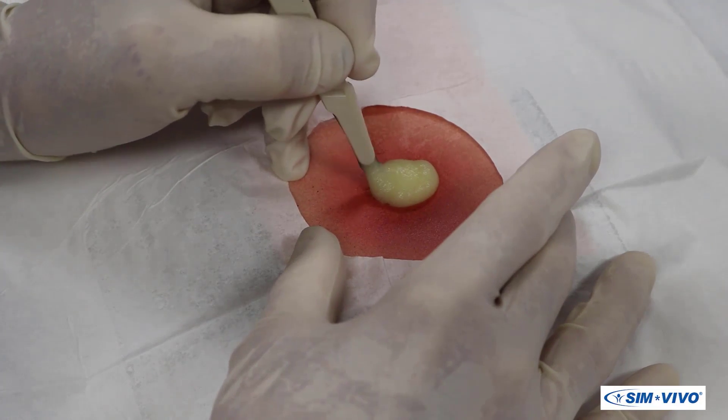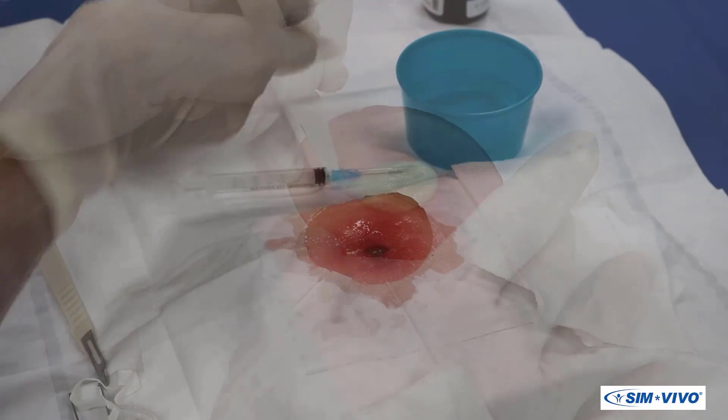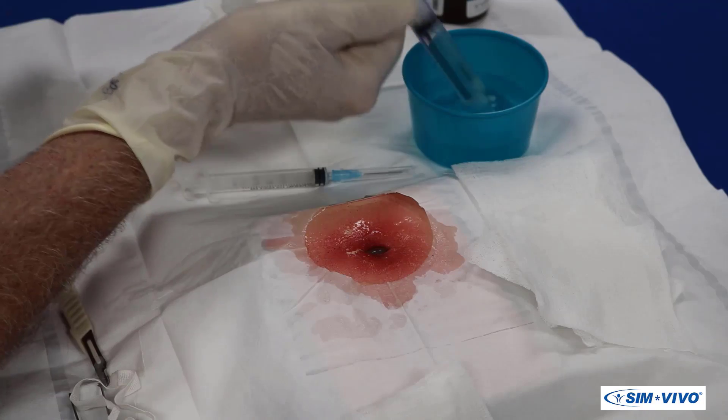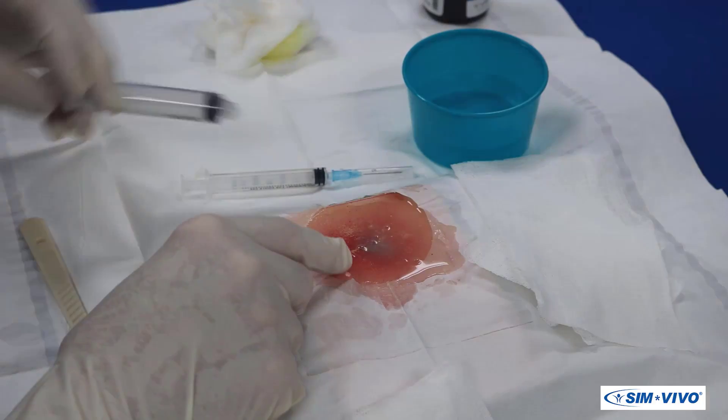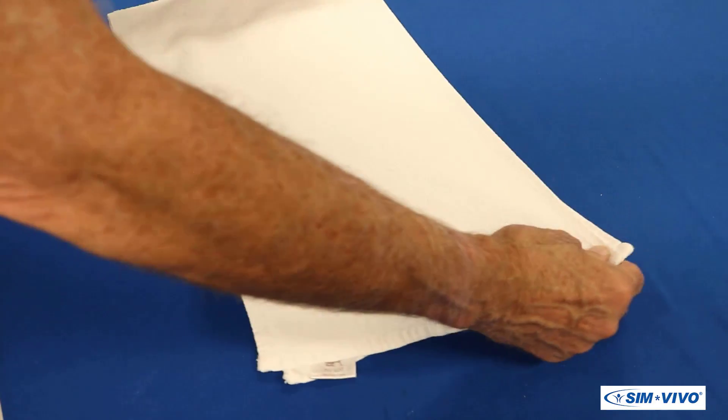Let's get started draining an abscess. Since the complete evacuation of the purulent material from the incised abscess may require copious irrigation, we recommend placing a towel on the table you will be using.